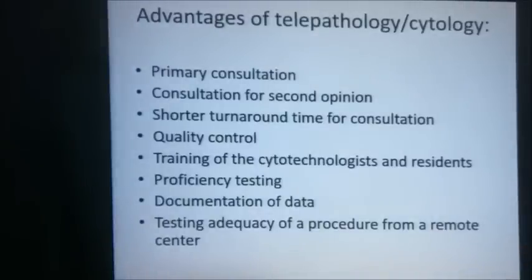So what are the advantages of telepathology or telecytology? First, primary consultation. You can be asked to do the reporting as the first pathologist using digital pathology. This is now what's going to happen all over. The reporting will be online.